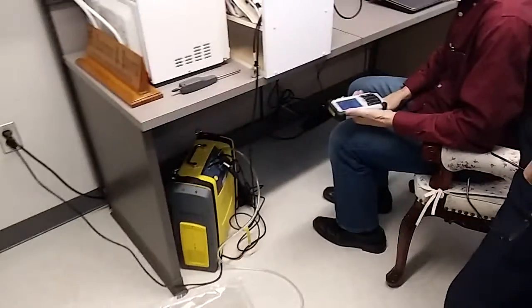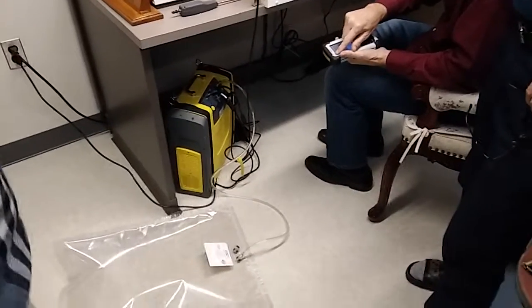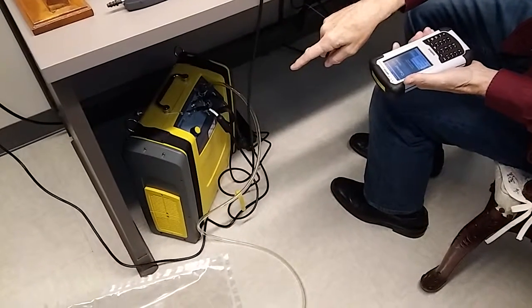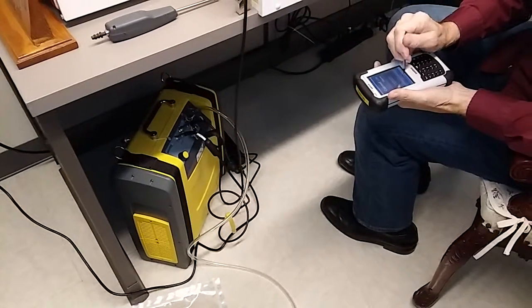PDA. And we're going to do a single point calibration. The PDA, you see the blue light? It's Bluetooth. Okay? And over there, you see the blue light? It's connected by Bluetooth. So now we're just going to do a single zero calibration.